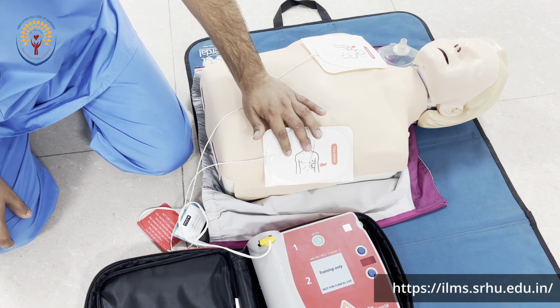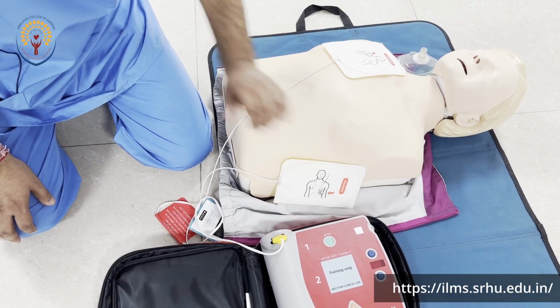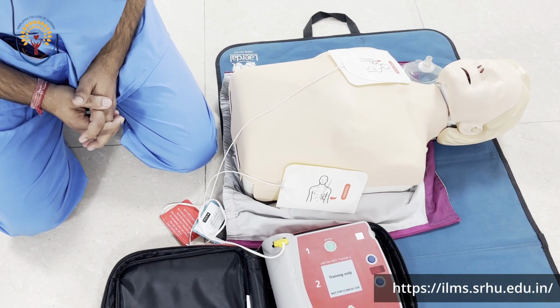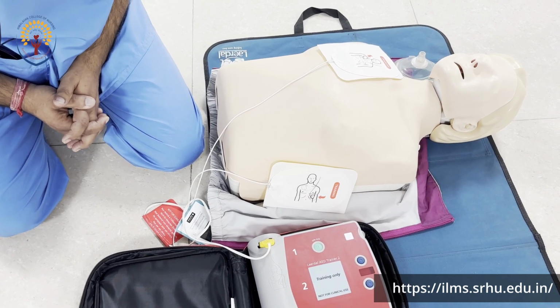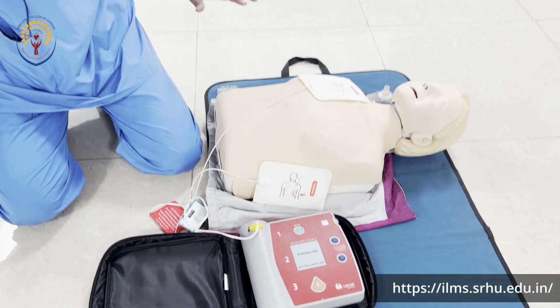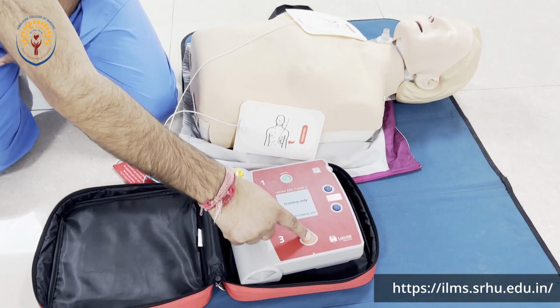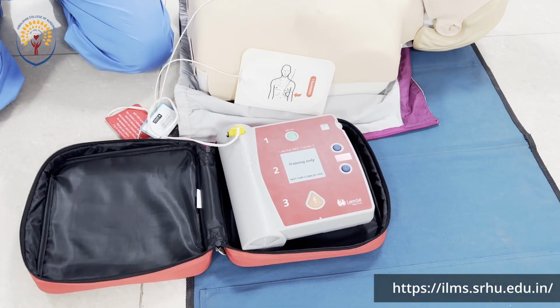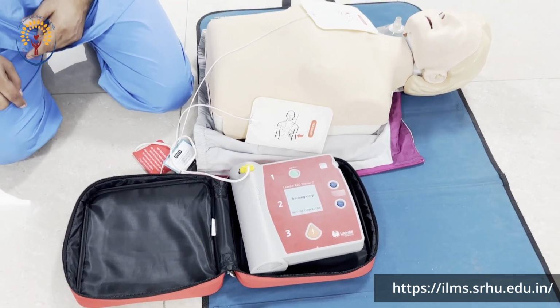Analyzing heart rhythm. Do not touch the patient. Shock advised. Charging. Stay clear of patient. Deliver shock now. Press the orange button now. Shock delivered. Paused. Start CPR.